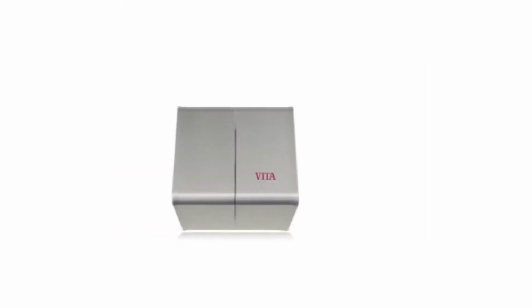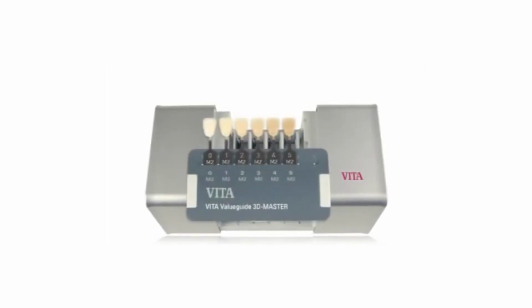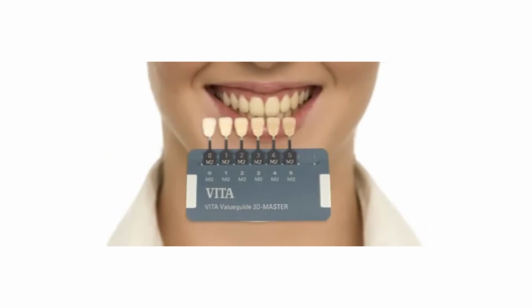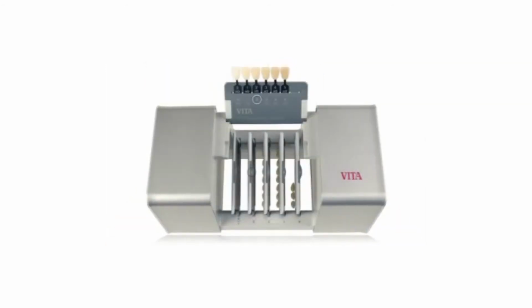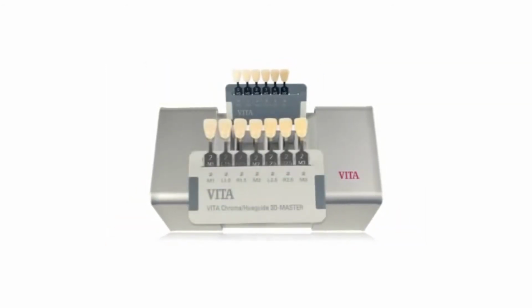A modification of the Vita 3D Master with a simplified presentation has been introduced. The Linear Guide 3D Master (LG), where the matching procedure is performed in a 2-step procedure. The tabs are grouped in levels that correspond to 6 lightness tabs. Each level has hue and chroma tabs that are evenly spaced, and intermediate shades can be predictably formulated.